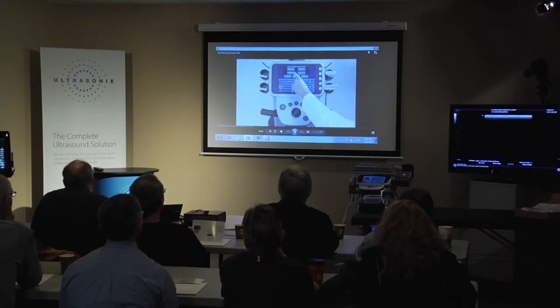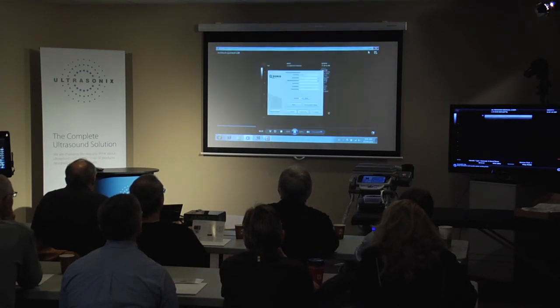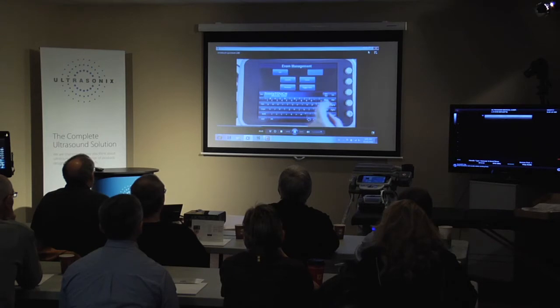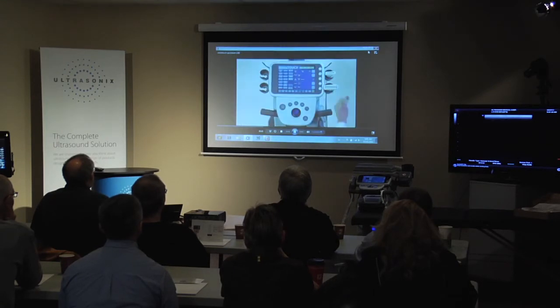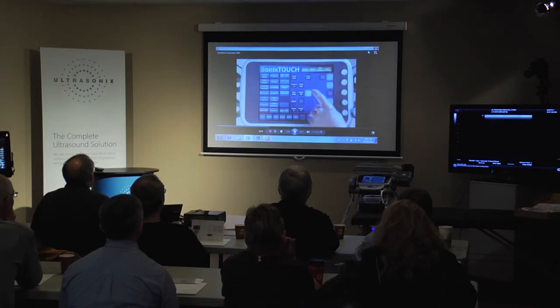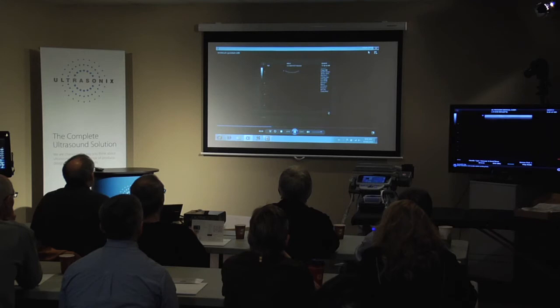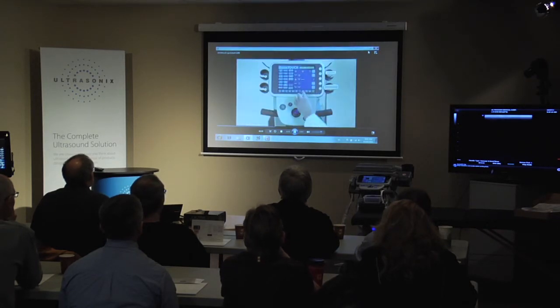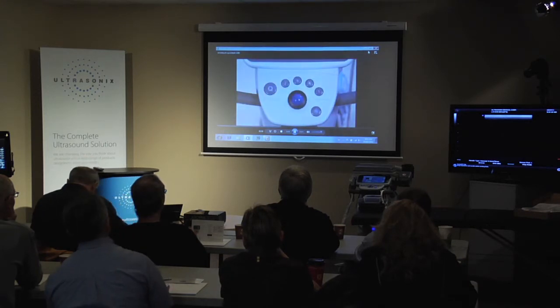Enter the patient information manually or by selecting More on the touchscreen to choose a pre-existing patient entry in the exam management window. Tap OK and begin scanning. The 5 dials to the right control the parameter options on the touchscreen. To manually change a parameter, tap it and turn the dial adjacent to it. Along the bottom of the touchscreen, imaging modes are displayed. Simply tap the mode to activate. Toggling between active modes is achieved using the Update button on the console.